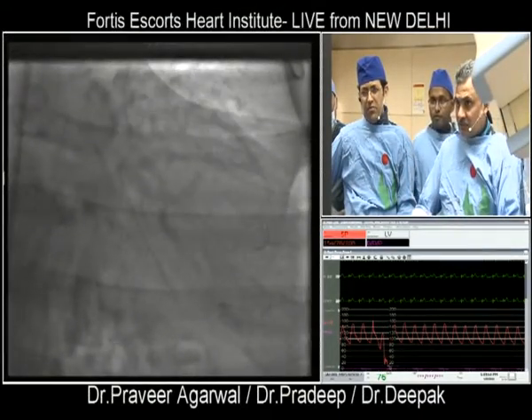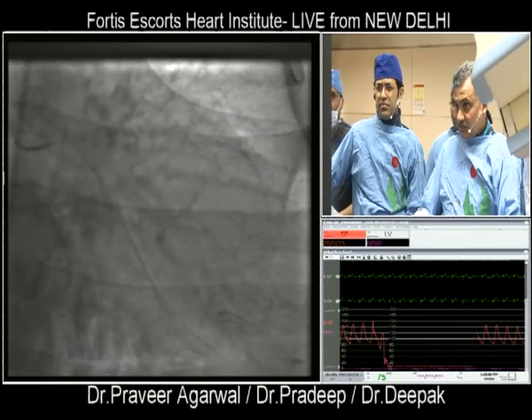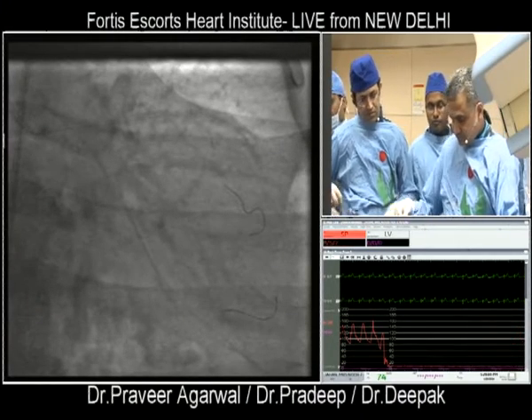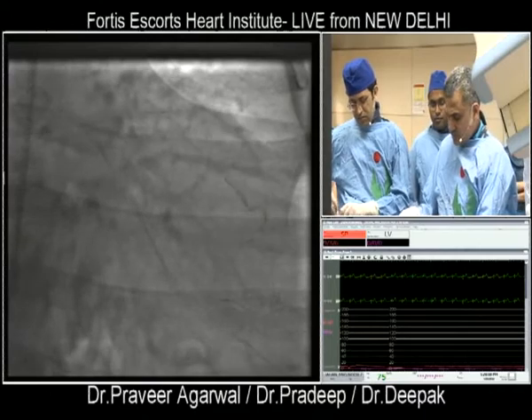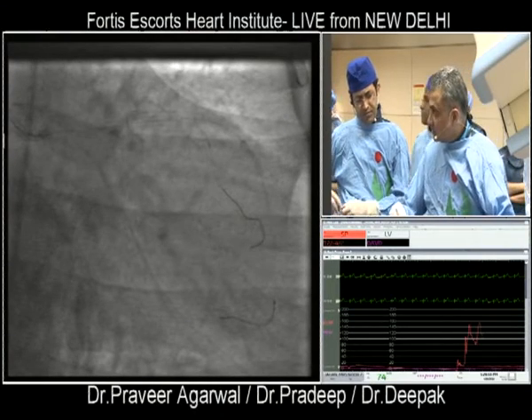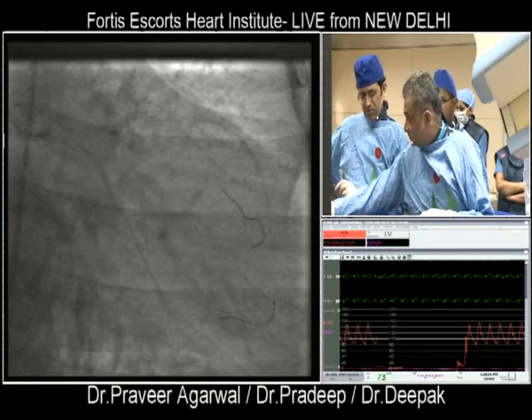See your point, fair enough. Or I take two short stents. I think I would just let me try short stents first. Give me a 2.5 into 24.